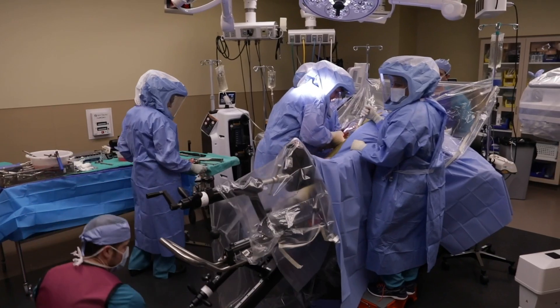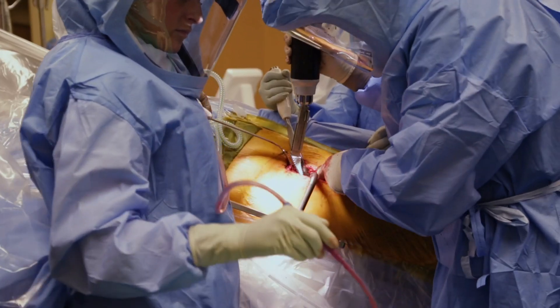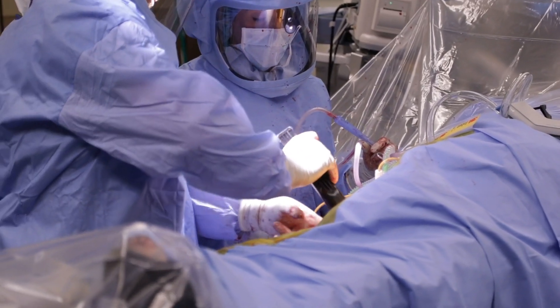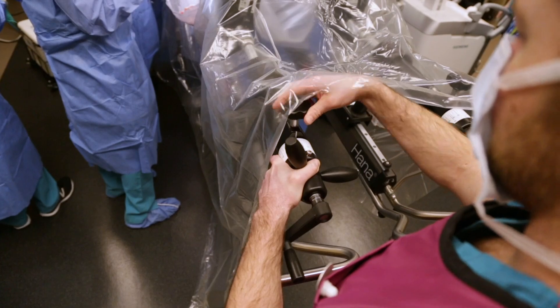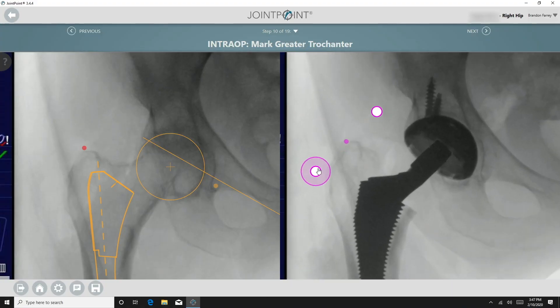Surgery continues and the femur is exposed. The proximal femoral releases are performed and the femur is broached using the Concise impactor. The trial stem is then reduced with the trial neck — standard or high — with the templated head. The C-arm is then brought back into position 10 degrees over with the leg 10 degrees internally rotated, reproducing the original proximal femoral image used prior to the neck cut for the One Trial Analysis.